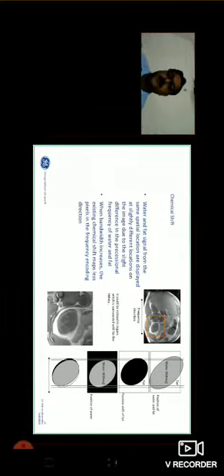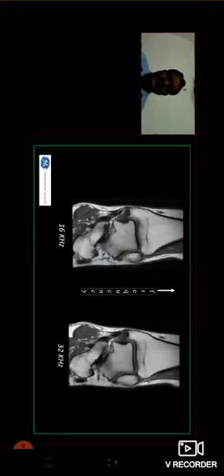Okay, so here you can see the bandwidth per pixel option also. This helps in setting the protocol for minimum pixel shift during protocol optimization. Some clinical examples: over here you can see this is 16 kilohertz receiving bandwidth.